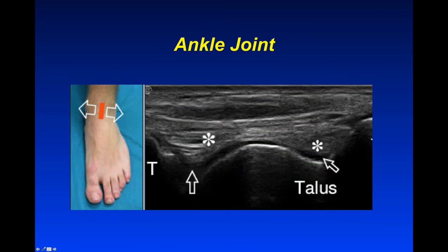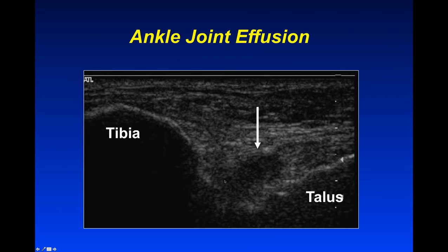For the ankle joint, we place the probe anteriorly and translate it back and forth, looking for the tibia and talus. It's important not to confuse the hypoechoic line of the articular cartilage on the dome of the talus for fluid — cartilage hugging the bone is normal. When you have an effusion it forms a teardrop shape. This patient had acute ankle trauma with a bloody effusion into the tibiotalar joint, forming that teardrop shape.